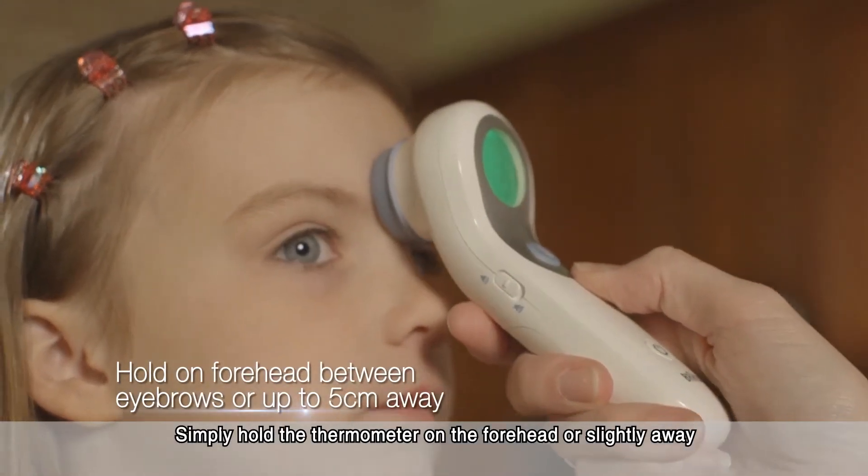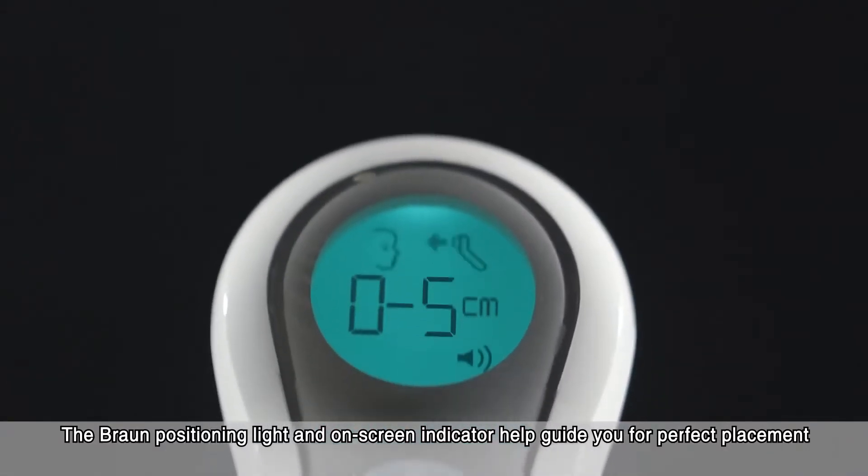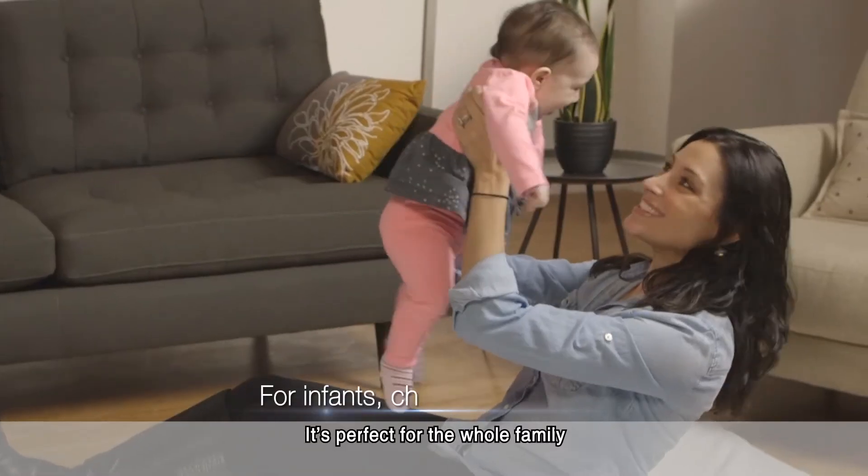Simply hold the thermometer on the forehead or slightly away. The Braun positioning light and on-screen indicator help guide you for perfect placement. Then just press the temperature button for a reading. It's perfect for the whole family.